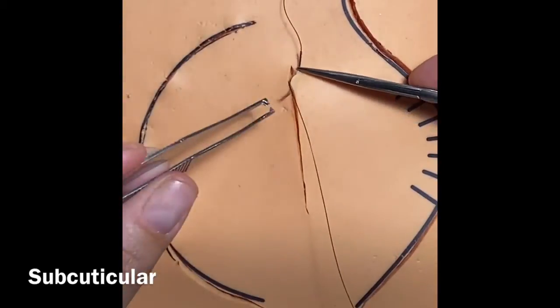Make sure not to come out with your needle in the loop. That will cause a knot and make it really difficult for you to keep going. Make sure your needle comes out not within that loop. Come through and reload.